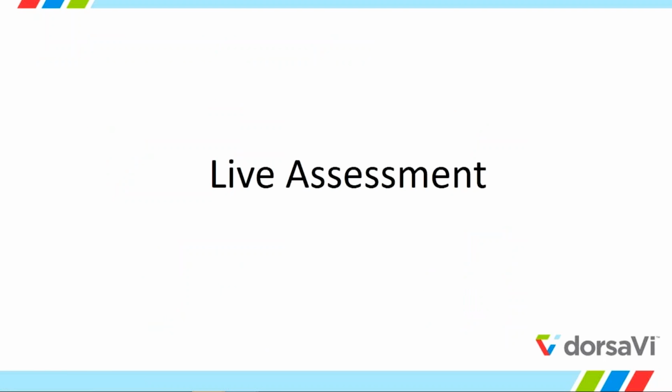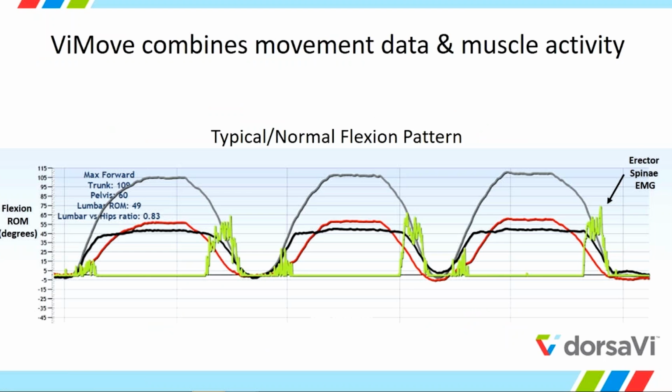So first, live assessment. I just want to look at data lines for just a second to kind of orient everyone to having an idea of what you're looking at when you're watching the screen. When you first get a dorsaVi system, if you're not somebody who's been in a motion capture lab, these just look like a bunch of squiggly lines on the screen. So it's a good idea to kind of study them and get an idea of what you're looking at.